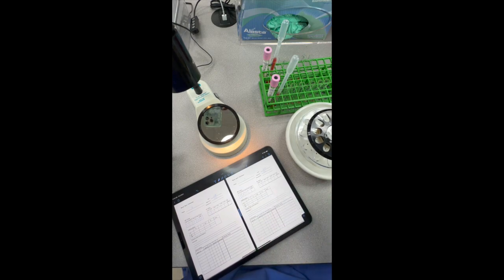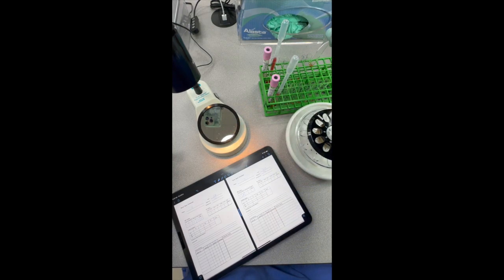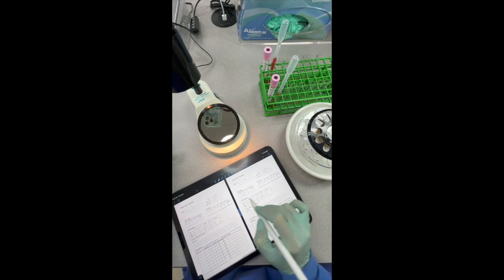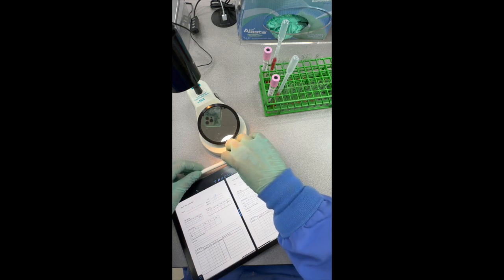But since they're A, we do expect them to have antibodies to B. And there we go. We get a nice 3+ reaction there. So we'll put 3+ in there. And this patient is typing as a front type A. And now we're going to move to our D. We're going to perform the weak D test.